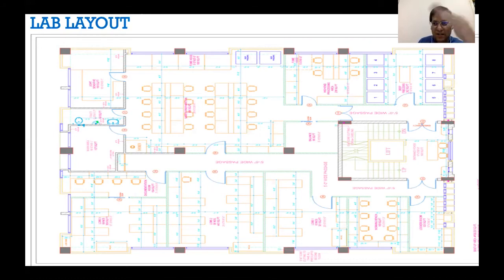There's a floor diagram layout. There we have proper space for sitting, like this is the sample processing area, bench. We do processing by sitting. This is the lab, and these are the lab benches, LCMS benches, 1, 2, 3, 4 rooms. There are 6 rooms, 6 machines, 3 machines. This is the documentation meeting room. On this side, if you come, these are the sample storage, deep freezers. This is a high-end processing area where we can handle highly sensitive machines and light-sensitive drugs.